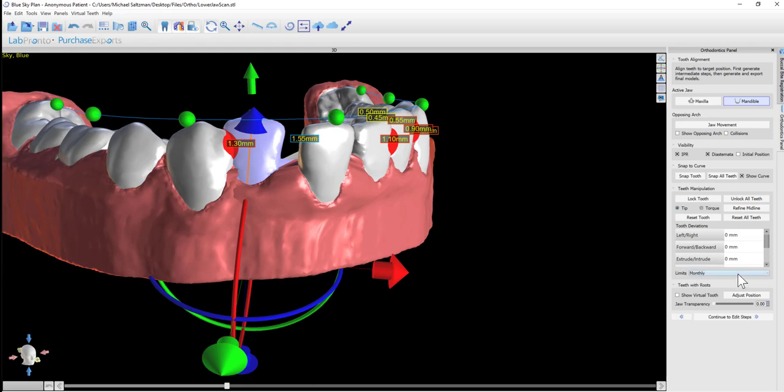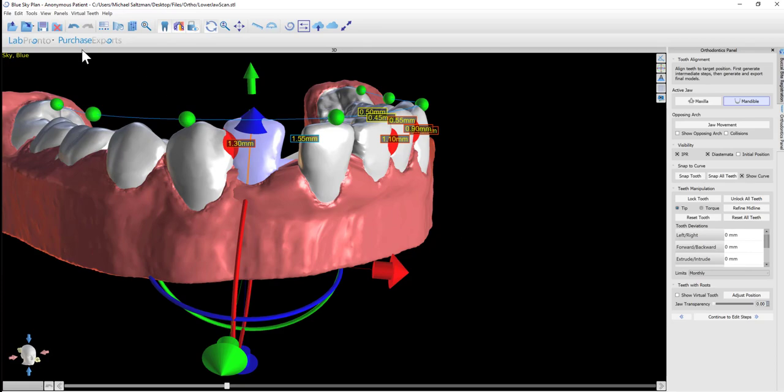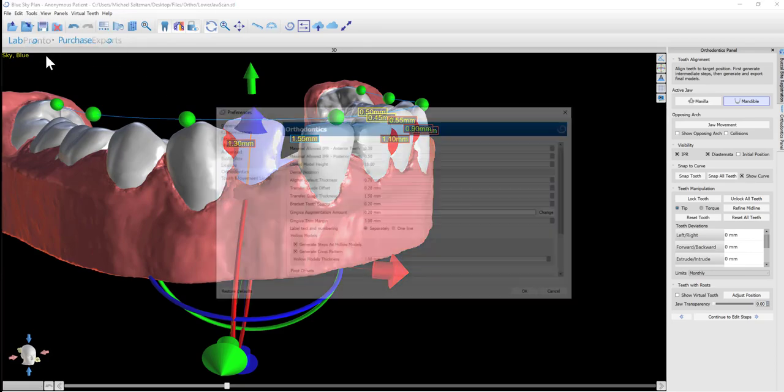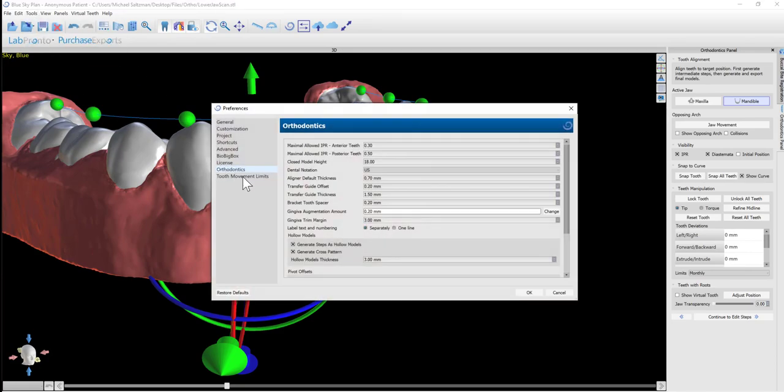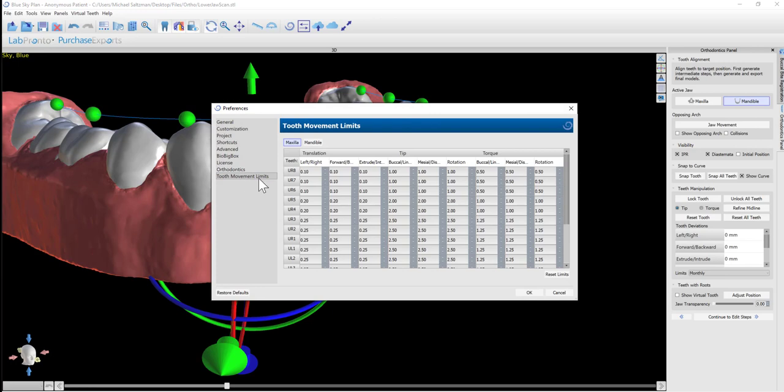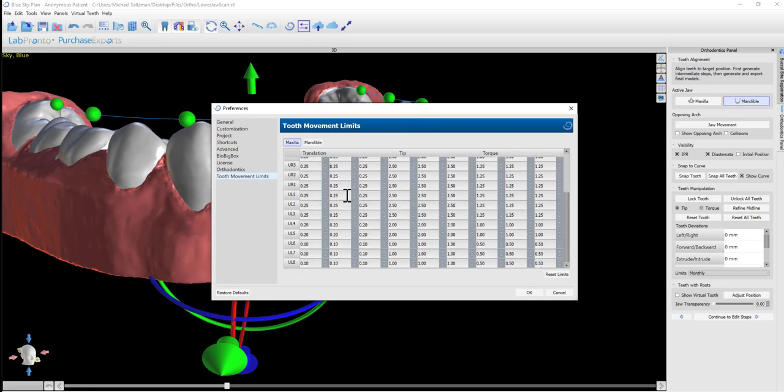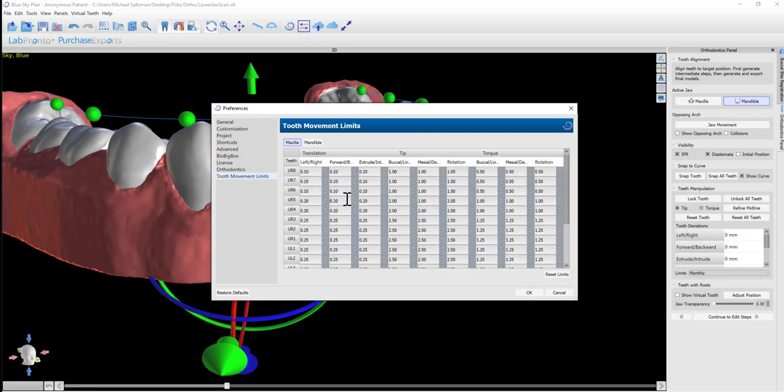You're able to select from the drop-down menu if you're planning on creating aligners for monthly, bi-weekly, or weekly. Why is that important? Because if we go to Tools, Preferences, we have our tooth movement limits. These are the default settings. If you want to change them, you can. Generally, there's no need.